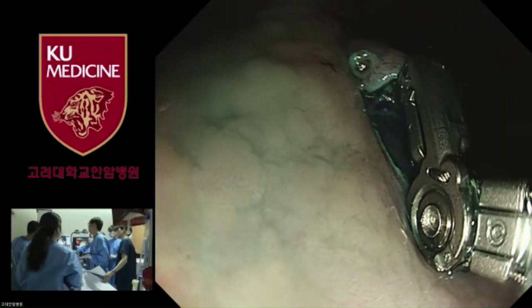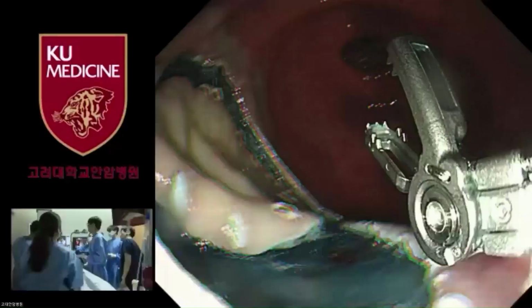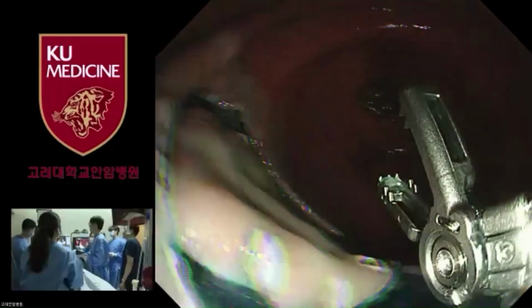No, the demonstration is fantastic. My only fear is that when you lift the lesion, you also lift the muscular plane that is behind the lesion. So you always need to be very superficial when you cut, because the muscle can come out, especially in the colon. And so I feel that you need to be very expert to use it, because then you leave the muscle.